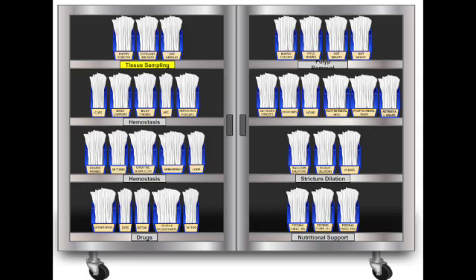That's fascinating. It really highlights the why behind just handing over the forceps. Exactly. And don't forget the different types of forceps you need ready. There's the standard cup. The jumbo cup, bigger bite, can even sometimes remove tiny polyps, less than 3 millimeters. Then there's a spike version. What's the spike for? It helps anchor the forceps, especially on slippery mucosa, lets you take multiple biopsies from the same area without the tissue pulling away.